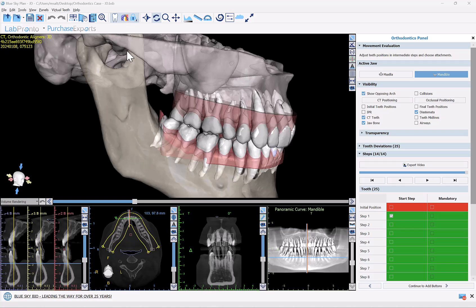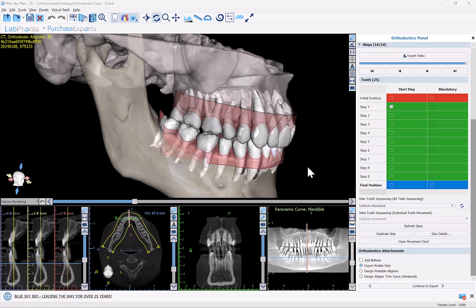Now that we've explained a bit about Blue Sky Monitoring and what we're viewing in the Blue Sky Plan software, let's discuss and present the new functionality to transfer the data from Blue Sky Plan to Blue Sky Monitoring. Now that I have the digital design plan completed on screen, I'm going to go down to the bottom of the panel and choose the option to continue to export.